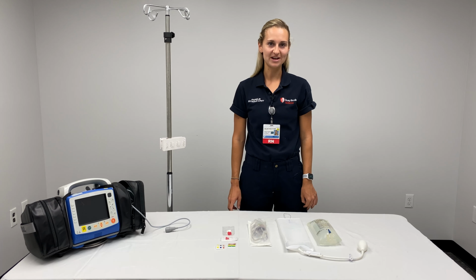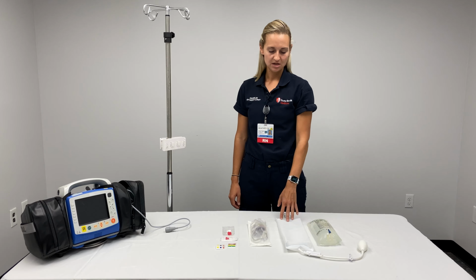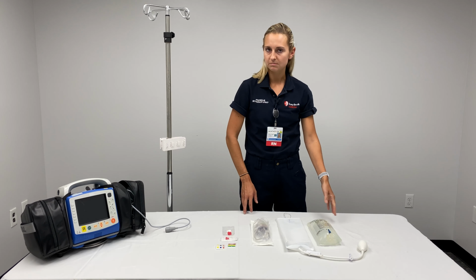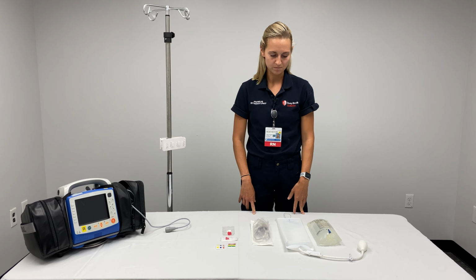So today I'm going to show you how to set up an A-line. You're going to need a 1-liter bag of normal saline, a pressure bag, an A-line setup, and extra red caps if needed. Sometimes people use them, sometimes they don't. The red caps will stand out a little bit more on your A-line if you prefer.